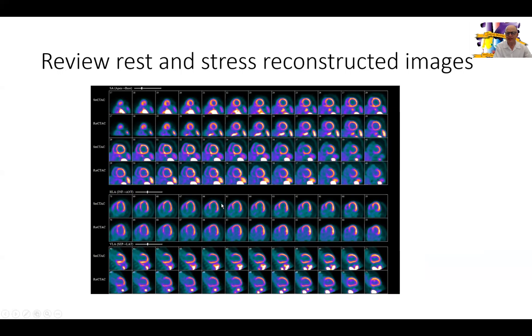Then we move to the standard review of rest and stress images — reconstructed rest images on the bottom and stress images on the top. You can see GI activity, not an unusual finding in patients undergoing rubidium pharmacological stress testing. We have a very minor defect towards the LV apex in the rest images. There is a dilated left ventricle and a minimal defect in the septum that goes away with stress — nothing to report as far as fixed or reversible defect, meaning no ischemia and no evidence of scarred myocardium.